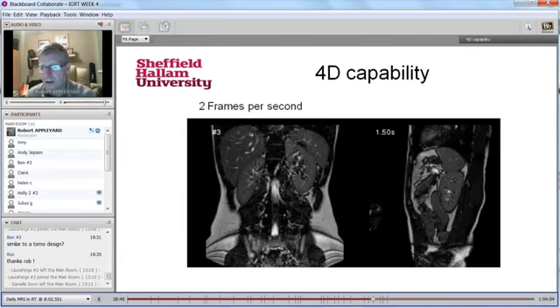And I think, yes, with the MR Linacs we can get real-time imaging, not quite at the same rate as we can with the ViewRay system. So this is half the rate, so 2 frames per second. Now this was originally a slide that showed this in real time, so 4D showed these things moving, but yeah, so you can see real-time movement here.